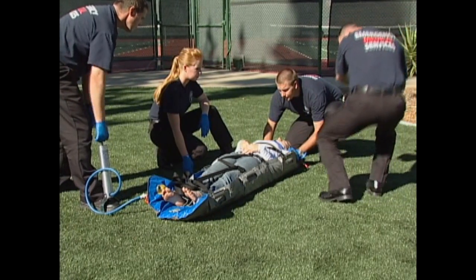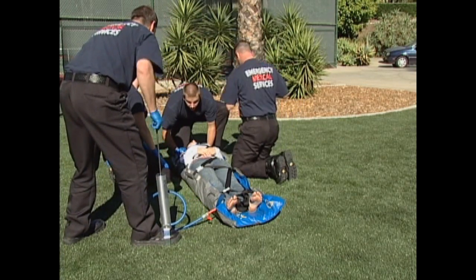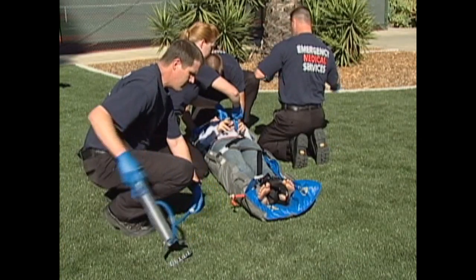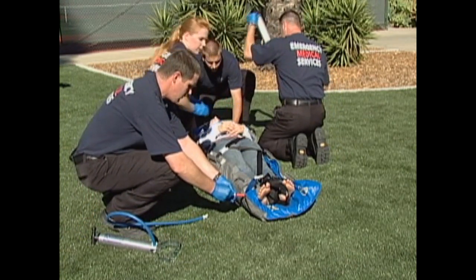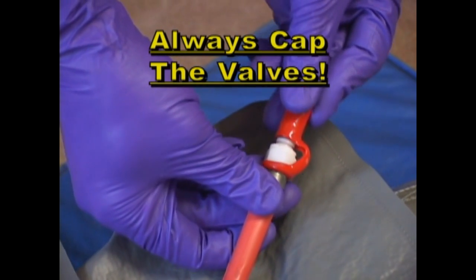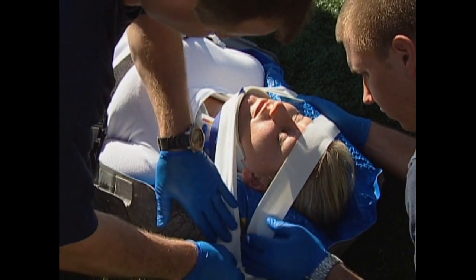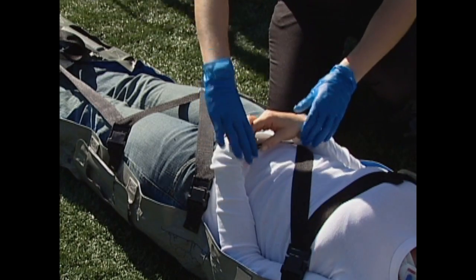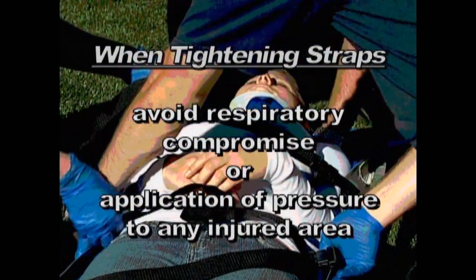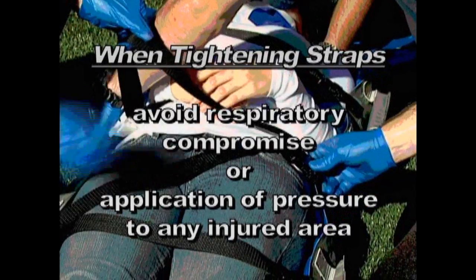Evacuate the vacuum mattress until the desired firmness is achieved. When using the Evacusplint mattress at high altitudes, more pump strokes may be required to achieve the desired firmness. To prevent accidental valve opening, whenever a patient is being moved in the mattress or when the mattress is being put away, always place the red leashed cap over the end of the maxi valve. Finish securing the patient's head using medical grade adhesive tape. Snug up the patient restraint strap and check the patient's neurovascular status before moving. Always use caution when tightening the patient restraint strap to avoid respiratory compromise or application of pressure to any injured area.